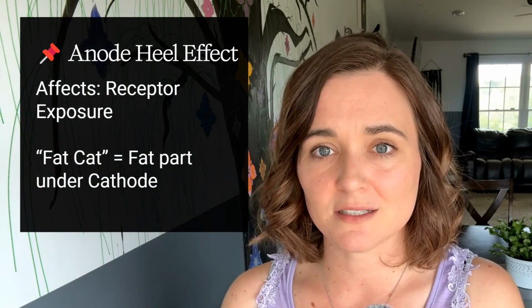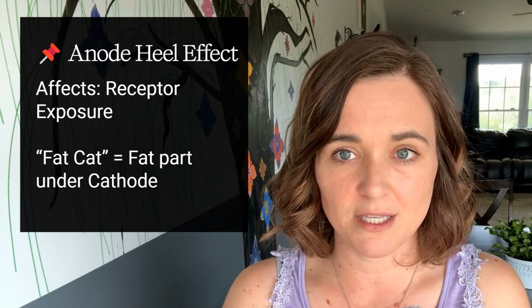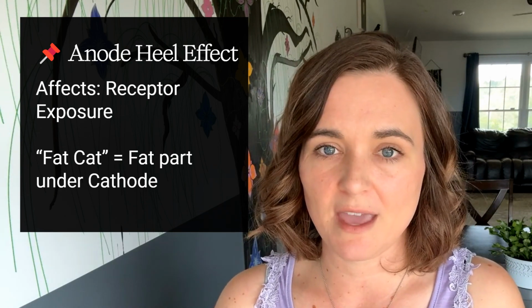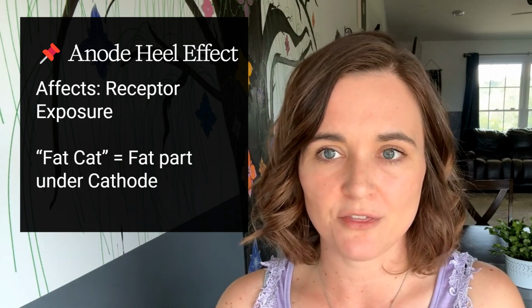The anode heel effect affects receptor exposure. The beam is stronger on the cathode end. Place thicker anatomy under the cathode side. Here's a mnemonic. Fat cat, fat part under cathode.